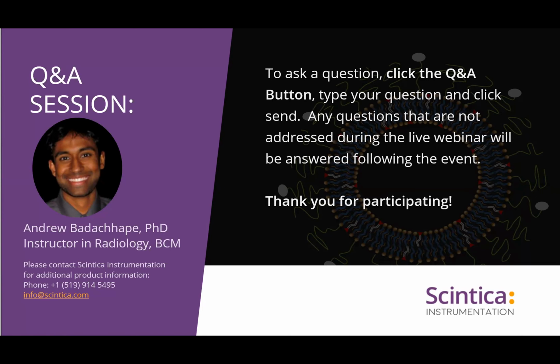We use gadolinium for these agents simply because it has such high signal enhancement. But there's no reason that we couldn't think about other contrast mechanisms like iron oxide particles or other types of molecules that have started to emerge, like ferumoxytol and its off-label use for vascular imaging. I think that these liposomal agents still have very strong clinical translation potential, however, because of the lack of exposure to the fetus, and also because with any sort of contrast-enhanced imaging mechanism, you always have to weigh the trade-off between costs and benefits. AKA, what is the benefit to the patient?